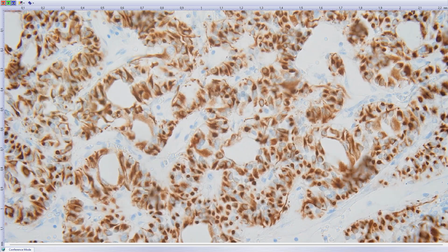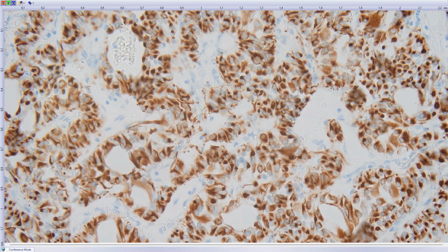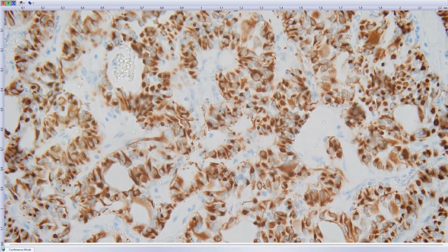So neuroendocrine markers are positive, cytokeratins with dot-like positivity, sustentacular cells are positive, with a little bit of paraganglioma morphology. And the lesion was called before cauda equina paraganglioma, and now in the new WHO classification is called cauda equina neuroendocrine tumor. We have two cases, I guess.